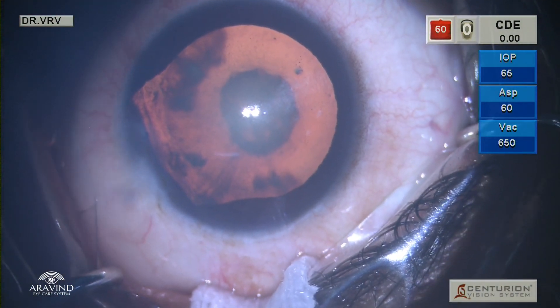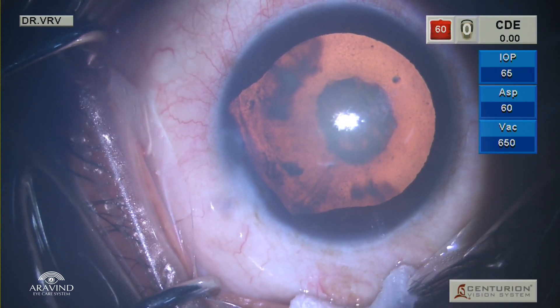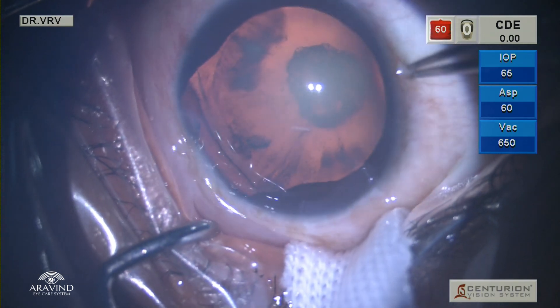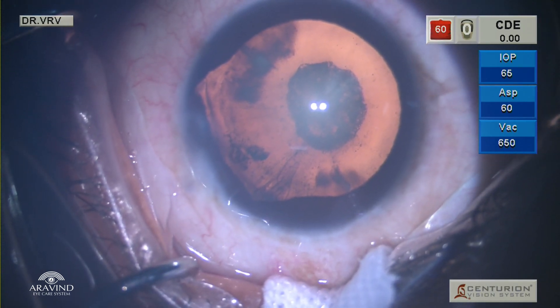This is a 45-year-old female who came with a history of stone injury to the left eye one year back, for which sclerocorneal tear repair was done. On examination, we could see zonular dehiscence from 5 to 7 o'clock position and there was absence of iris in the same clock hours.